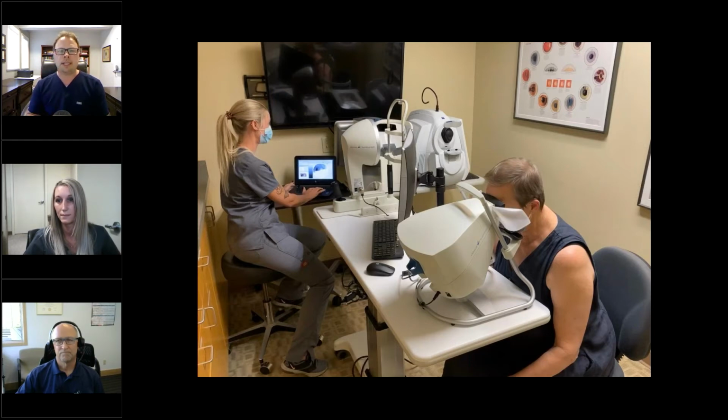The chart note is created. They don't have to redo that process. They don't have to schedule an appointment. They don't have to check the patient in. That's already been done. So we felt like that staff time we gained, those minutes, could be translated into helping the doctor be more efficient while this process is happening. So they put a lot of effort into helping keep us on time when we pull the trigger on an on-demand visual field test.